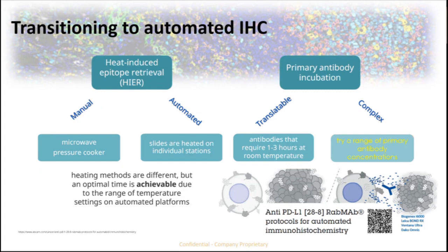We are happy to share with you the automated IHC protocol using various platforms such as the Leica Bond RX or the Ventana Ultra that you can use as a reference when you are doing the automated IHC staining.